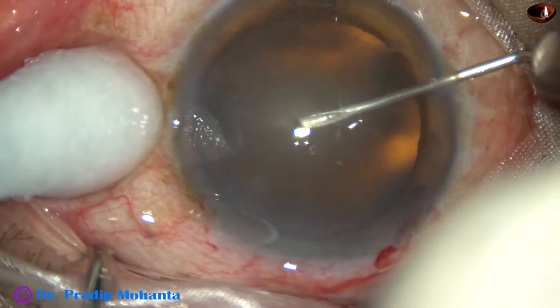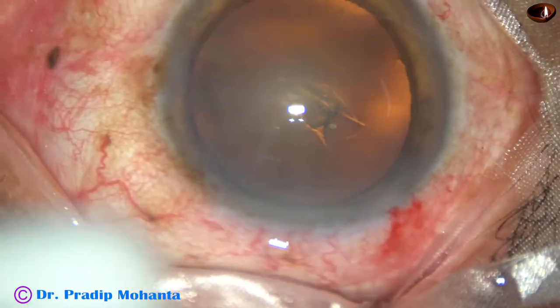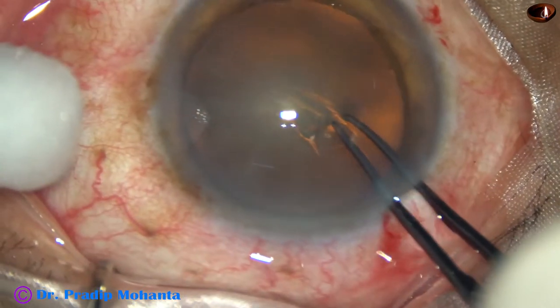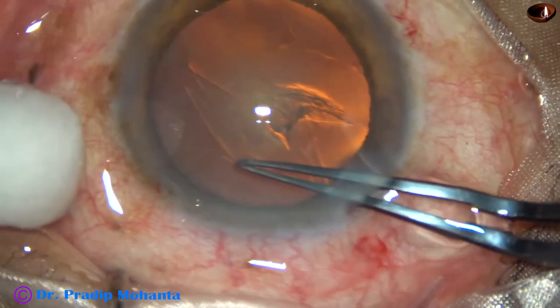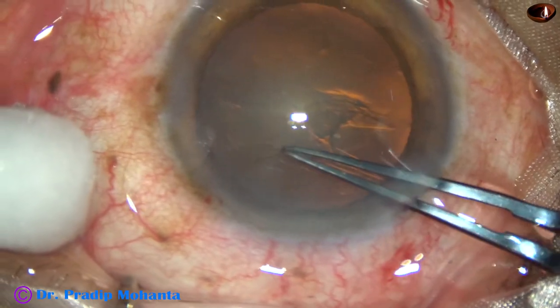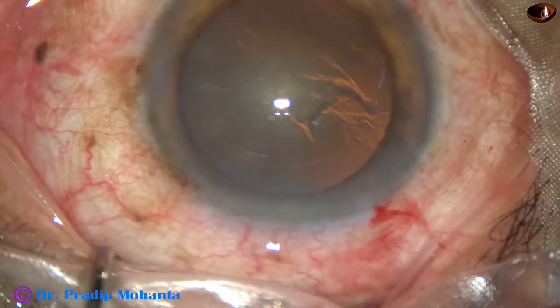After making the incisions and filling the anterior chamber with viscoelastic substance, capsulorhexis is being done now. A capsular tag has been raised by a needle, and now with the help of utrata forceps an adequate-sized, fairly round continuous curvilinear capsulorhexis has been performed.